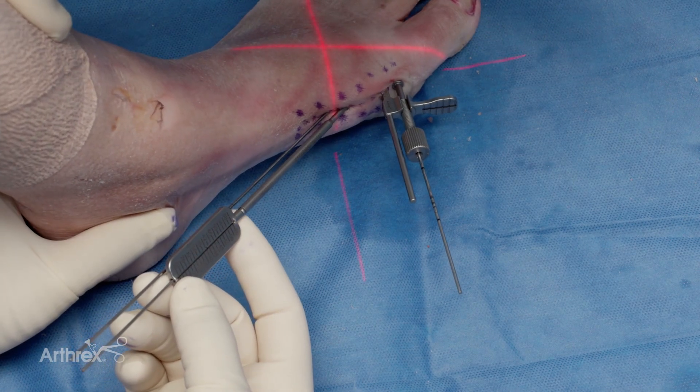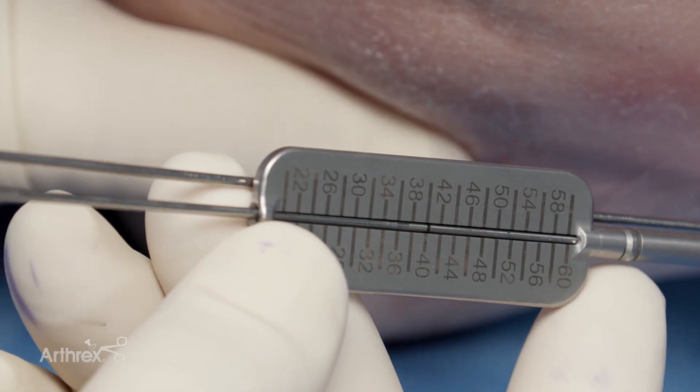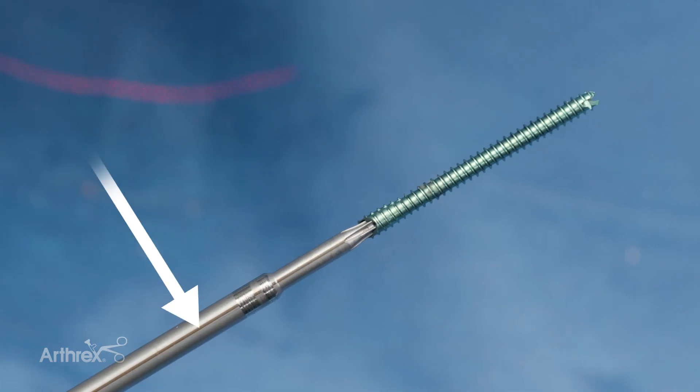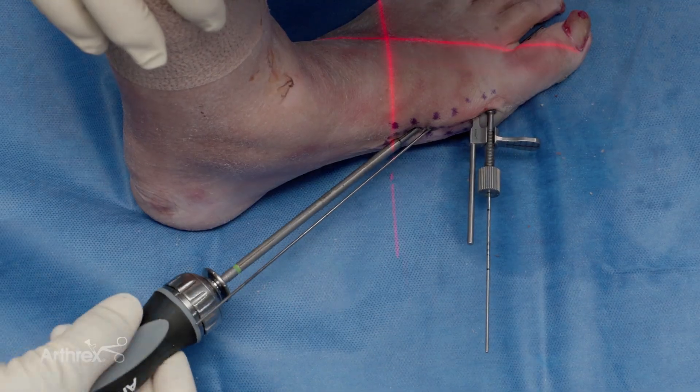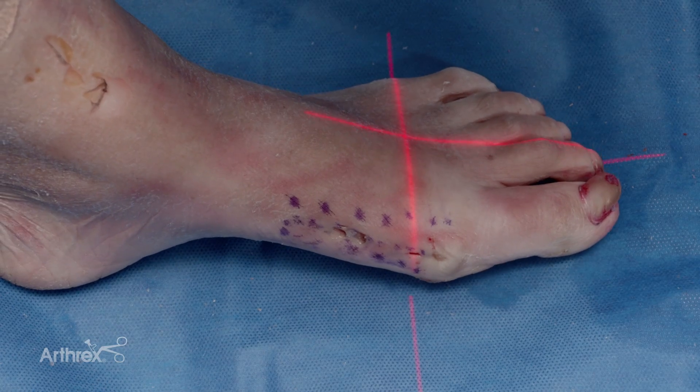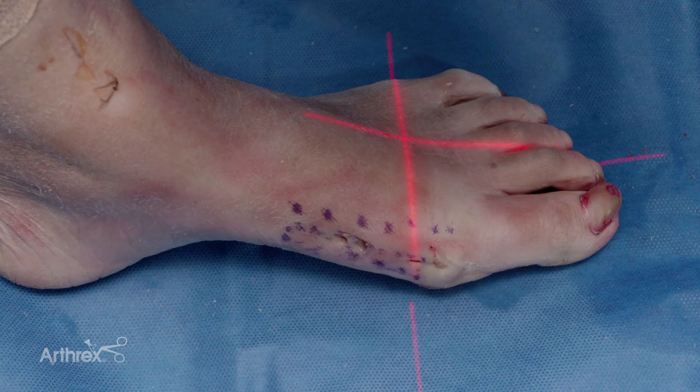We're now using the depth gauge — you can see the laser line measuring just over 40. There's also a laser line on the shaft of the screwdriver, which helps you confirm the screw is flush with the metatarsal with fewer fluoro shots. We're happy with both positions of the beveled screws and the overall shift of the capital fragment. We would then proceed with the Aiken portion of the MIS, as well as shaving down the overhanging ledge of bone on the distal medial metatarsal. If you want a more proximal starting point, the 25-degree angled guide provides a slightly sharper angle.